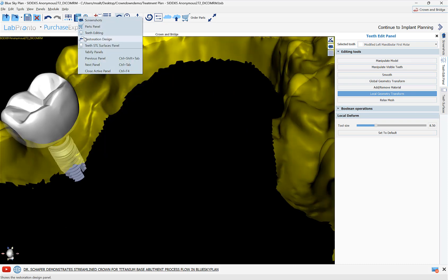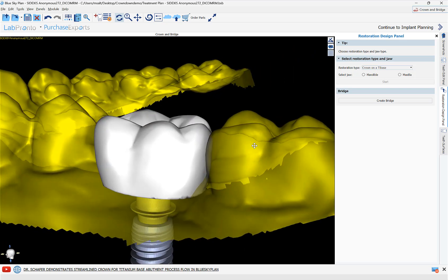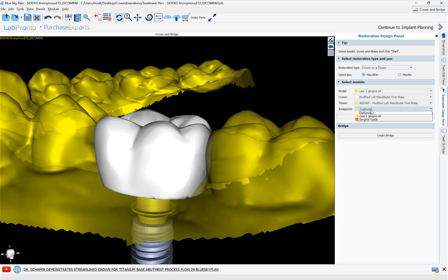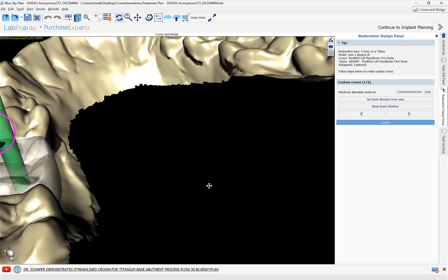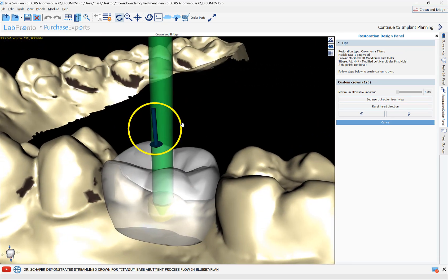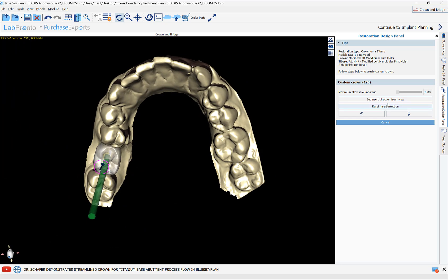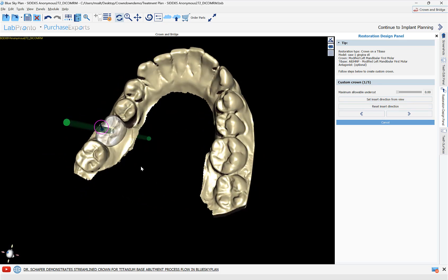Once we're done with our crown design, click on Restoration Design. We're going to turn our crown into a crown for a titanium base abutment. Confirm the selection of Crown on a Tie Base, select the draw type as Mandible, and confirm the settings: the model is our yellow model, the crown is our crown, the tie base, and the antagonist if we have one. Click Start. We will confirm the path of insertion — either use the arrow on screen or align the model and select 'Set Insertion Direction from View.' Once happy with the path of insertion, click Next.